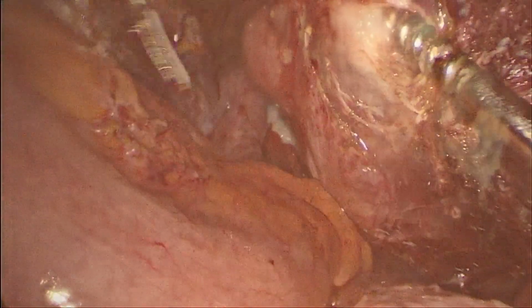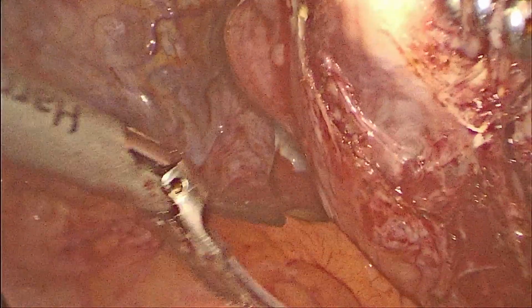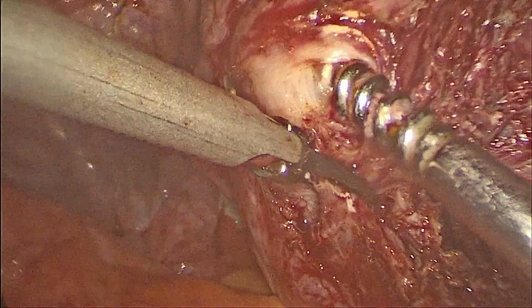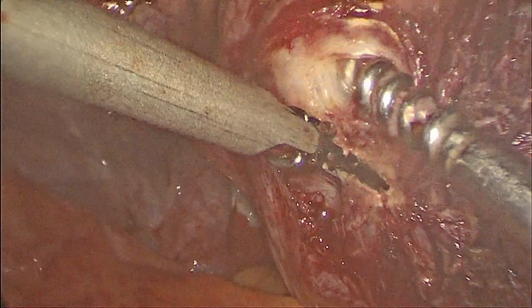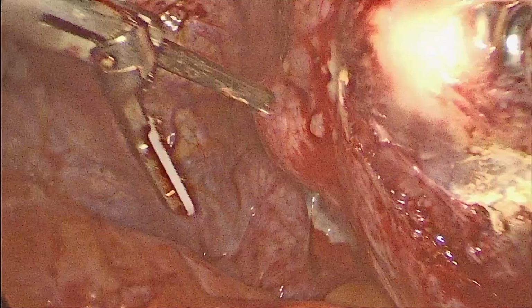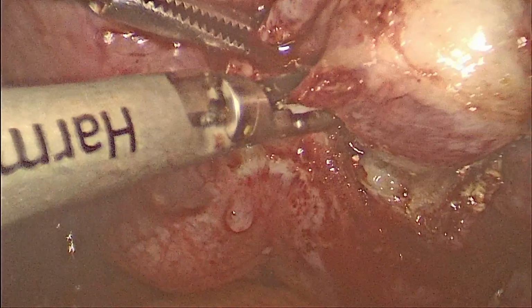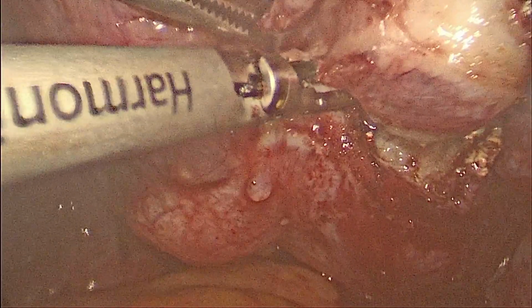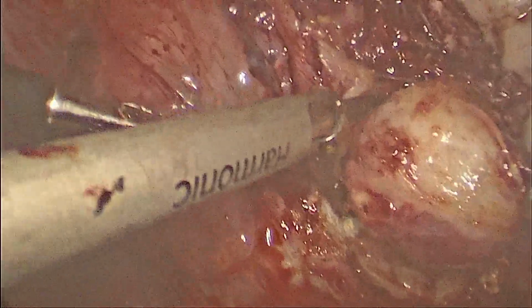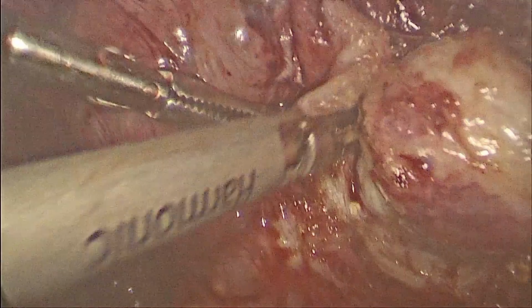This is one more fibroid released through the similar incision. In one vertical incision, we could remove nearly 4 myomas: one of 3 by 2 centimeters, one of 2 by 2 centimeters, and one more of 2 by 2 centimeters.